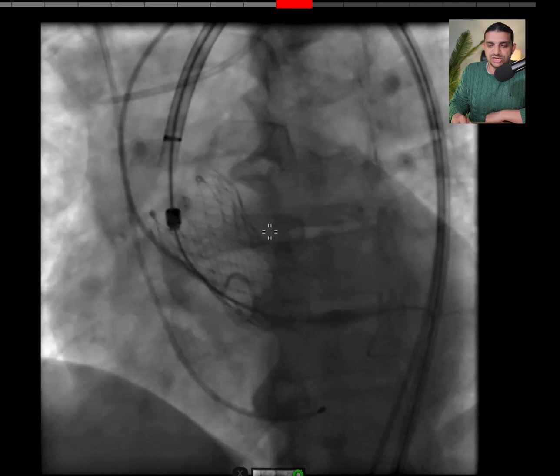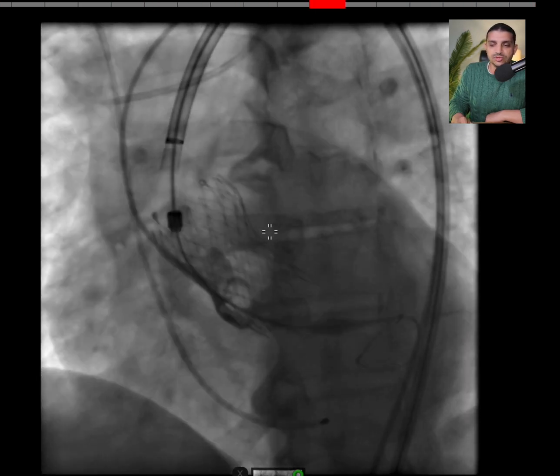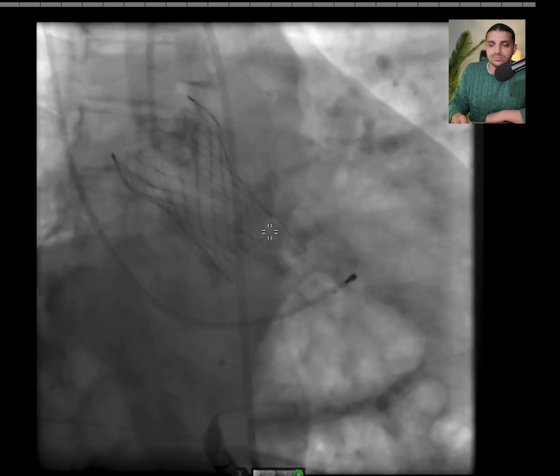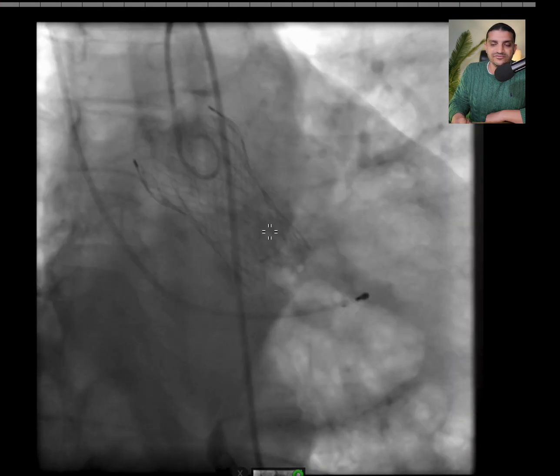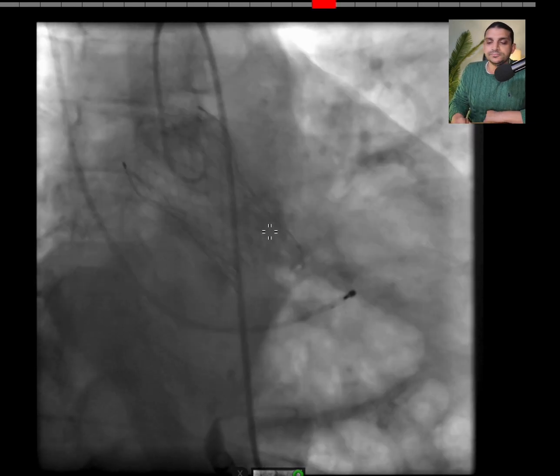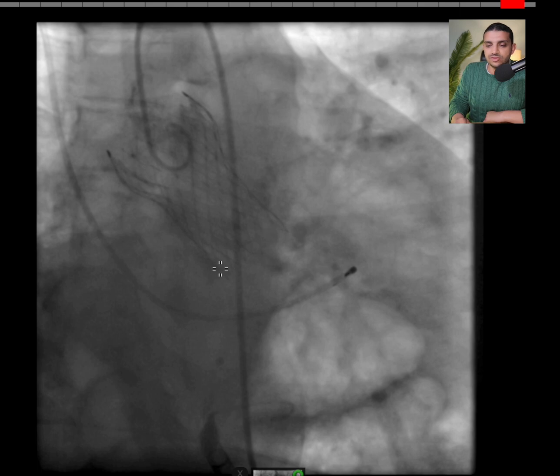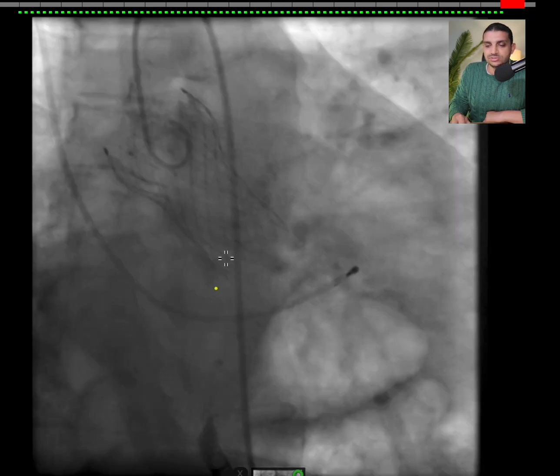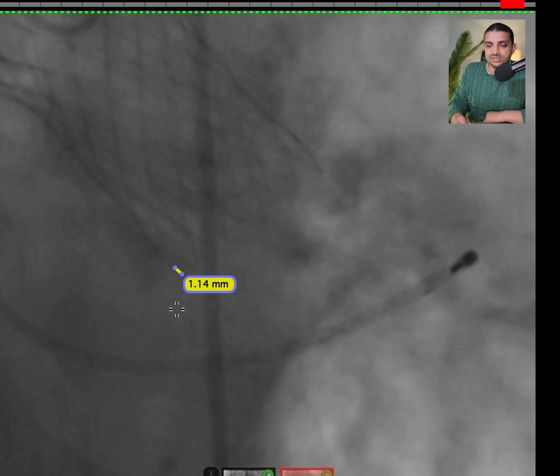Your injection has to be when the pigtail is in the aorta. Here we can see a very good result — this is a bit higher than what we wanted. We have like one millimeter below the annular plane. Let me zoom in a little bit — you can see that it is 1.14 millimeters.